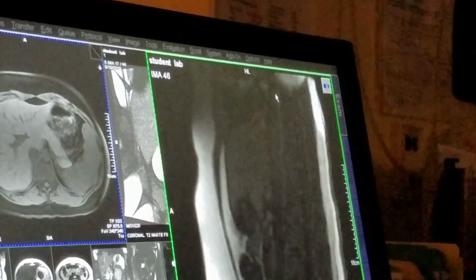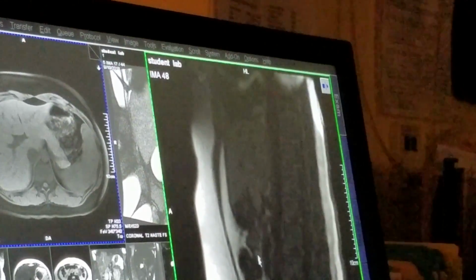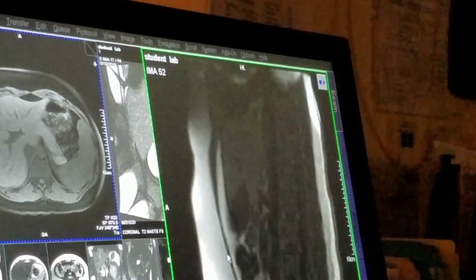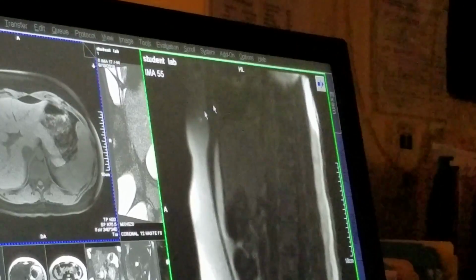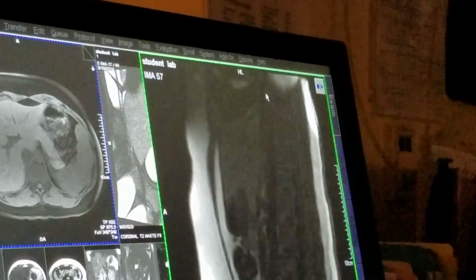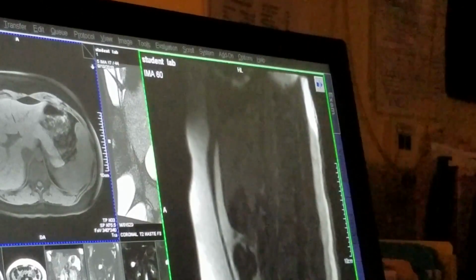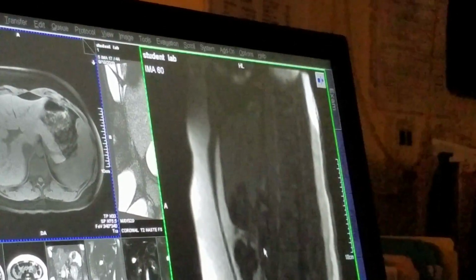However, I'm not going to hit stop and continue until the abdominal aorta is opacified and they've actually stopped holding their breath. So when you see it here, it should give them just enough time to take a breath in and hold it, so that way, the care bolus right now, that's okay.